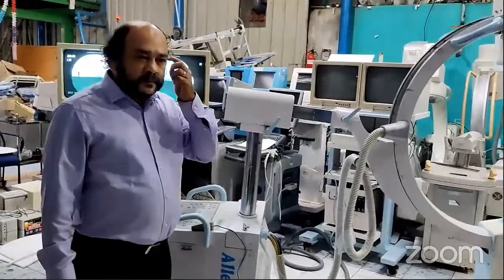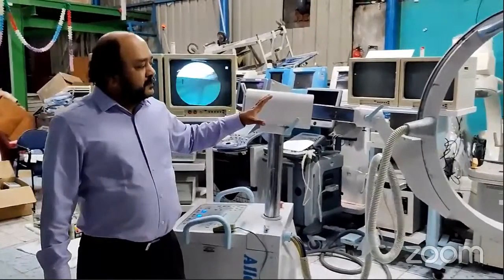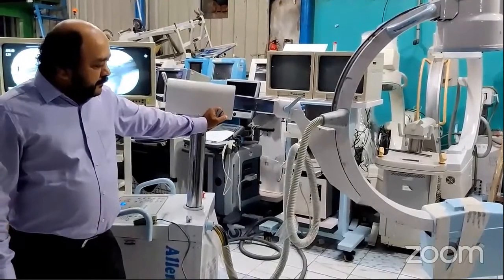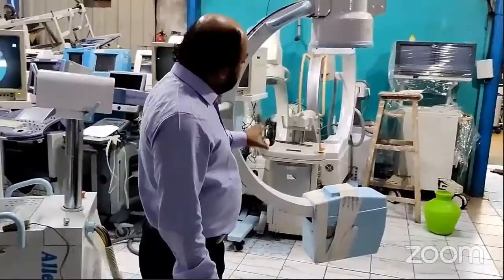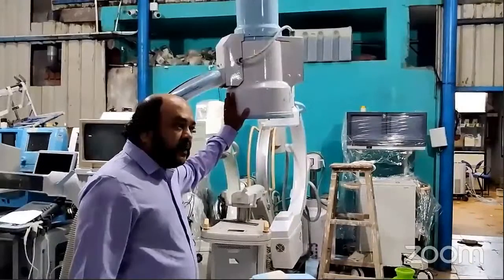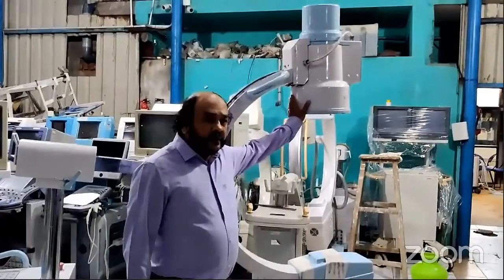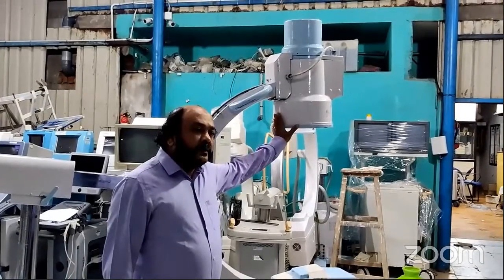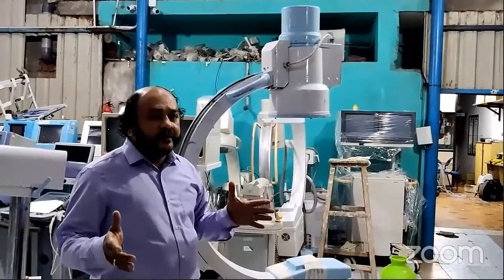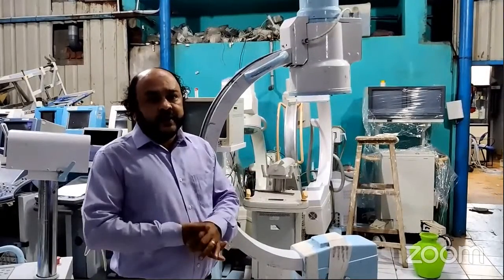In the C-arm, there are two parts. One is the X-ray tube, this is the X-ray tank. This one is the image intensifier. Now this is an old type of image intensifier, like the CRT. You heard of the old TV and all that, they use the cathode ray tube. Like that they use this.